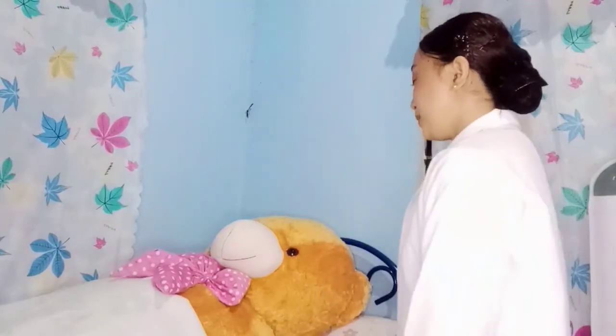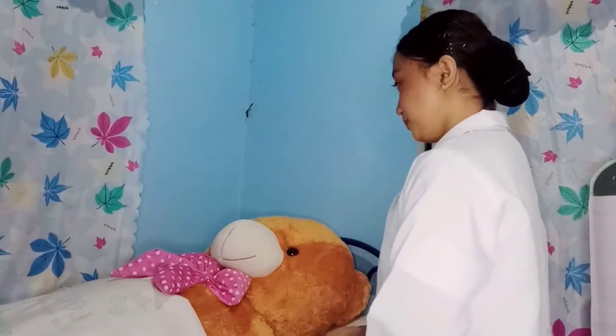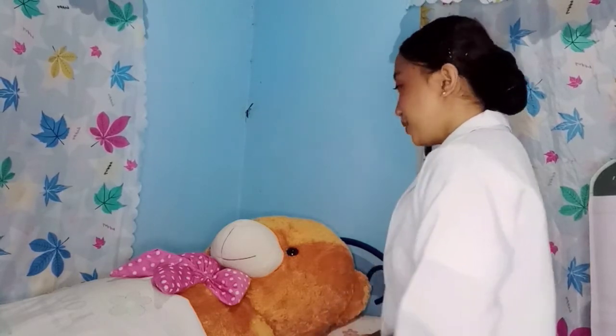So, good day ma'am, my name is Meljude D, your student nurse for today. May I know your name ma'am? I'm Meljude D. Bocobo. How old are you po? 20 years old. Okay ma'am. And then next, close the curtains around the bed and close the door to the room if possible.